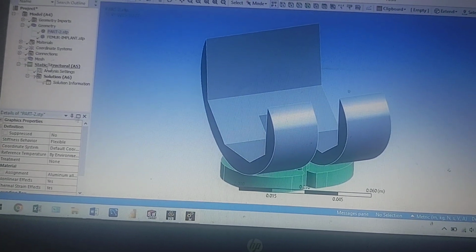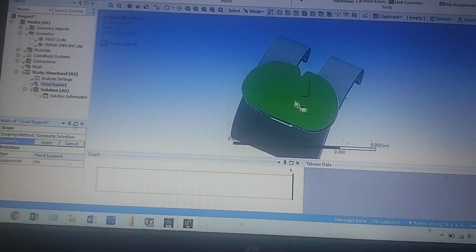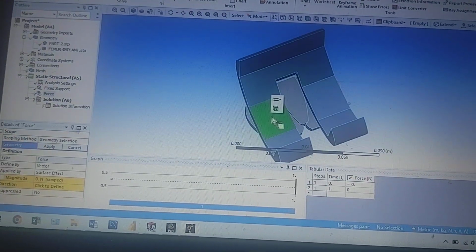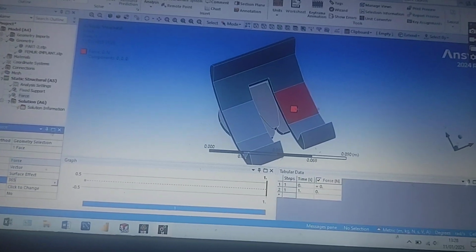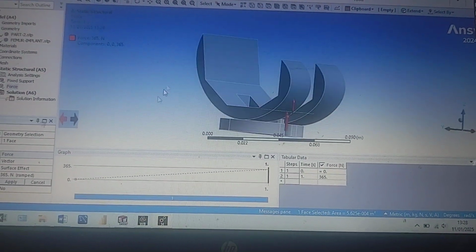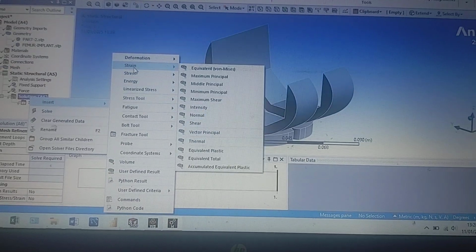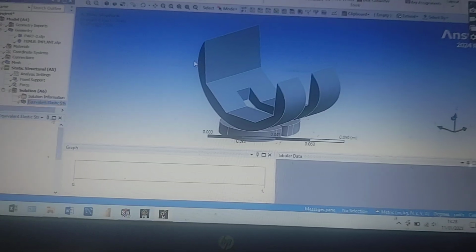Then go to meshing and static structural. Apply fixed support or any other type of support you need, and apply force or remote force, whatever you want. Click on this face, apply, and give an arbitrary magnitude. If you want to change direction, you can change it here. This is tensile force. We want compressive, so click here. Go to solution, find stress, and click on solve. This will solve your model.